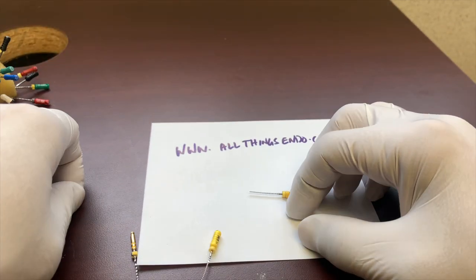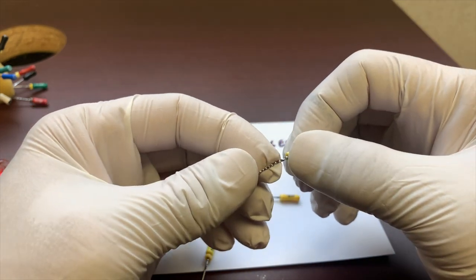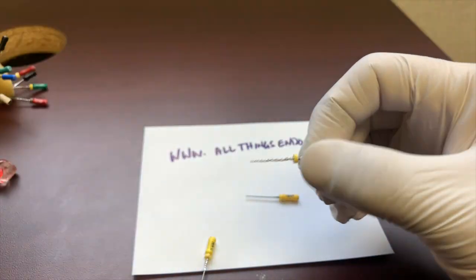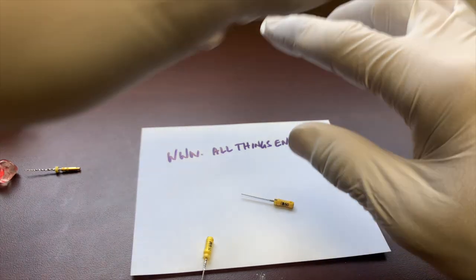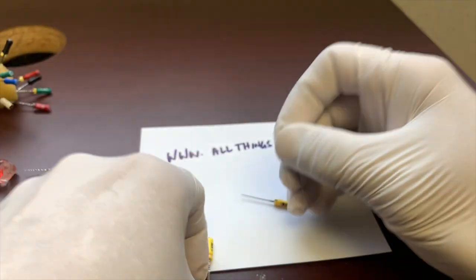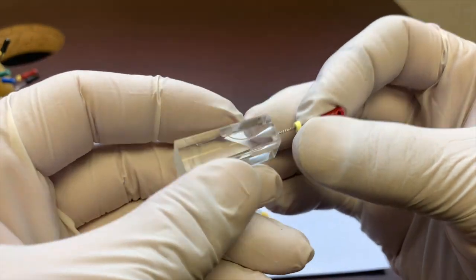Now you can also do your balanced force technique with your rotary file as well. I'll do that if I've got a curve that I'm not feeling comfortable getting around with my nickel titanium files. With my rotary files, I'll use the balanced force technique. That's extremely rare, but it may happen. So let's go ahead and see how the balanced force technique works. I'm going to tackle this canal with a 25 file and I'll show you if I can do it. Usually you get your glide path and go 10, 15, 20. Let's tackle it just with a 25 nickel titanium file.